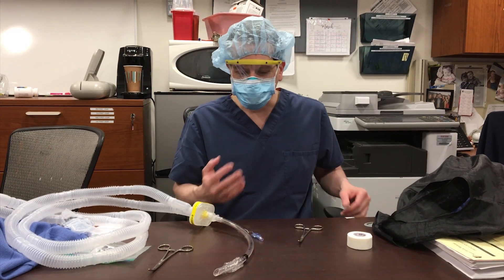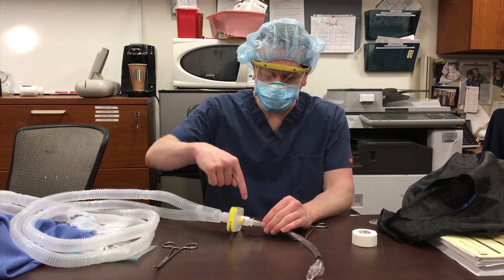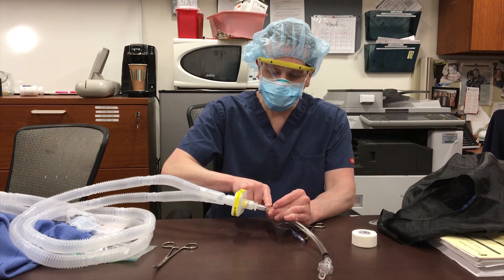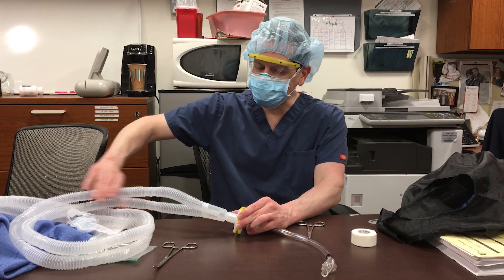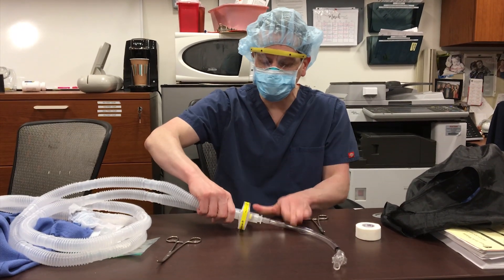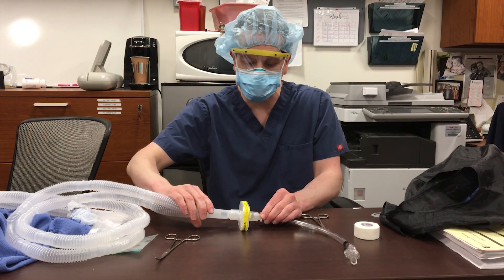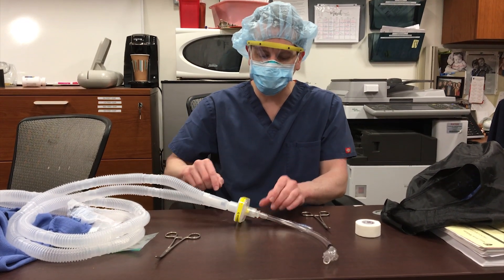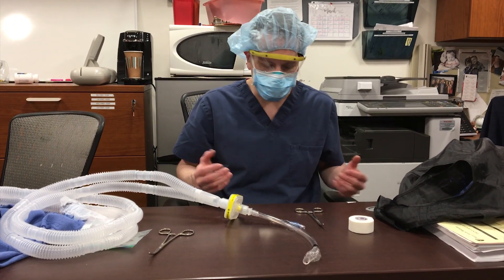The second C is clamping. The time you need to clamp is when you're going to have a circuit break between your viral filter and the ET tube. If you have to have a circuit break more proximal — for instance, you wanted to put an end-tidal CO2 right here — then you don't need to clamp the tube. The viral filter is your clamp. But let's say we wanted to put an inline suction here between the viral filter and the endotracheal tube.